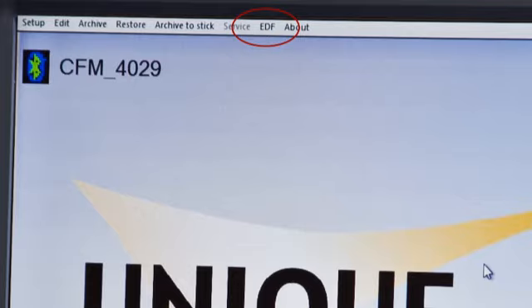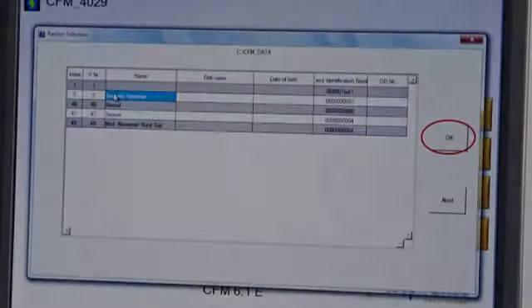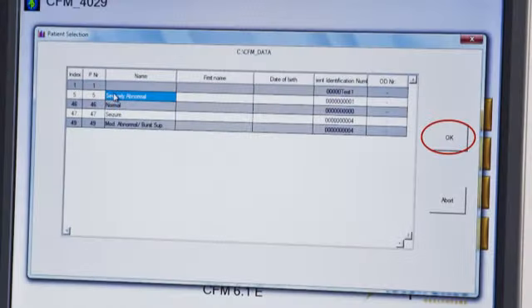To export in EDF format, click on the EDF button at the top of the master screen. Follow the instructions on screen to archive the data.